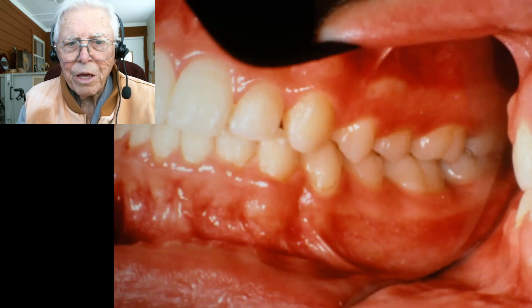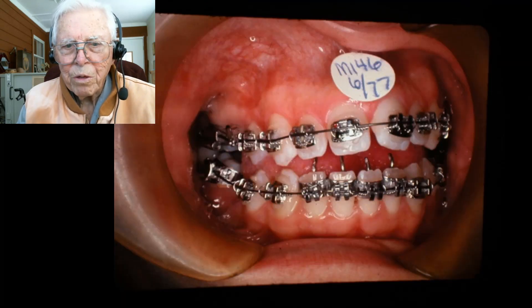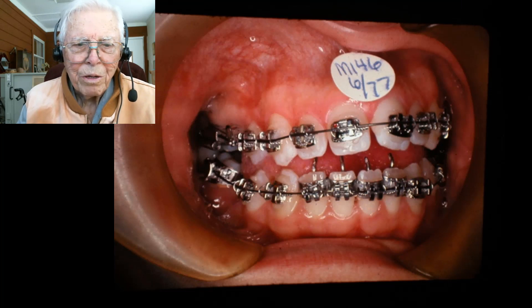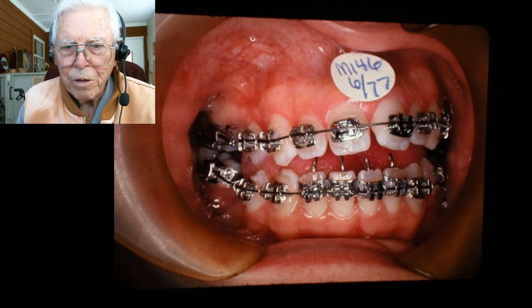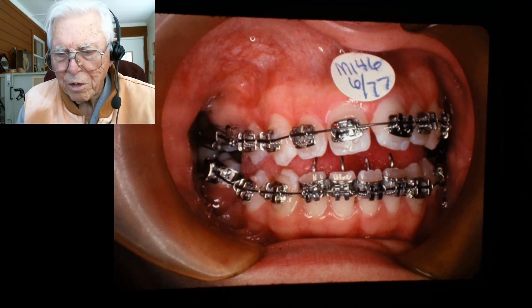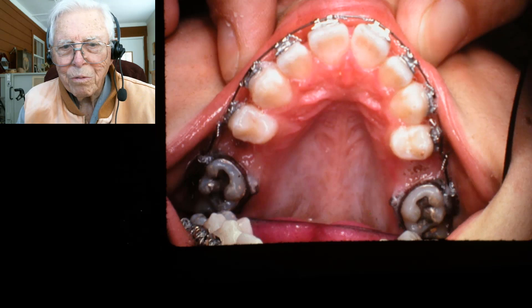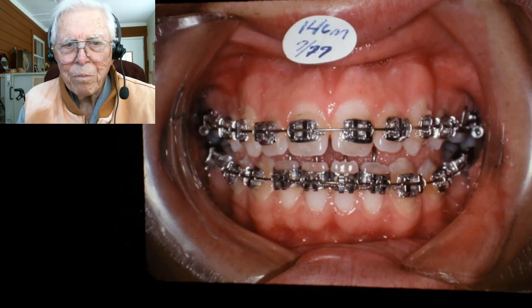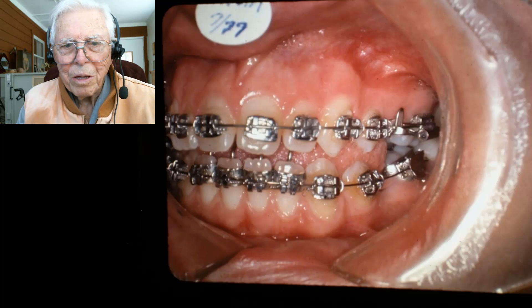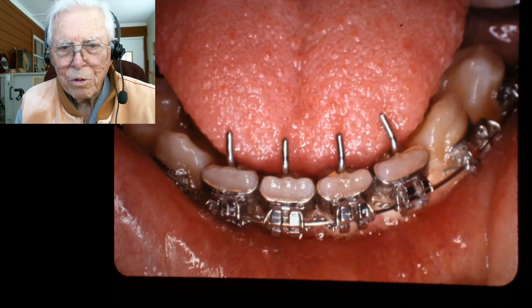The next case is number six — a young lady who had some bicuspids removed. We banded the teeth and put the little fingers on that, and it gets the tongue the same way and is able to correct it in that manner. There it is, the way it fit, and that case worked out good too.